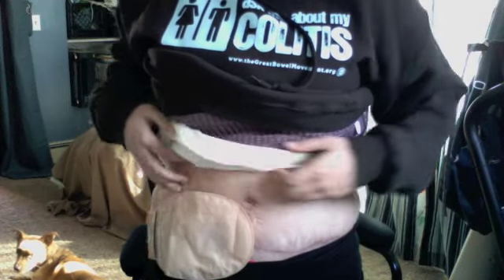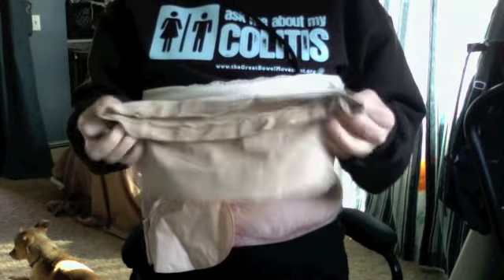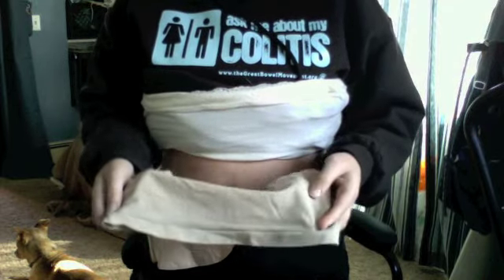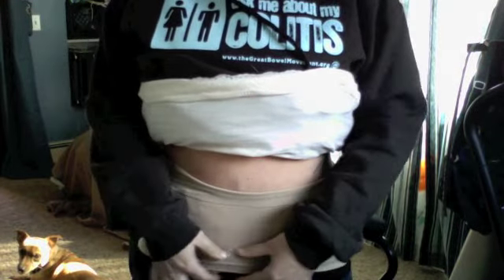Let's say I was wearing regular jeans, not maternity jeans, which you should all be wearing maternity jeans. I wore this, which is actually a pregnancy belly band, but there's a lot of pregnancy stuff that works great for ostomates. I wore just plain old tube tops, but I can't find any of them anywhere. So this is how it would work. This is weird, sorry. So belly band over, like this, regular jeans here.